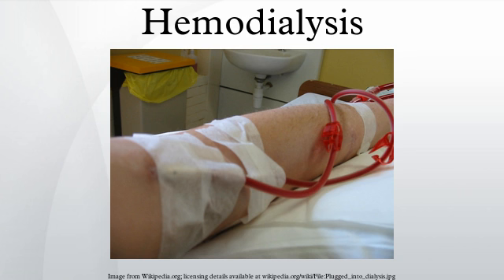Catheter access, sometimes called a CVC, consists of a plastic catheter with two lumens which is inserted into a large vein to allow large flows of blood to be withdrawn from one lumen, to enter the dialysis circuit, and to be returned via the other lumen. However, blood flow is almost always less than that of a well-functioning fistula or graft. Catheters are usually found in two general varieties, tunneled and non-tunneled.